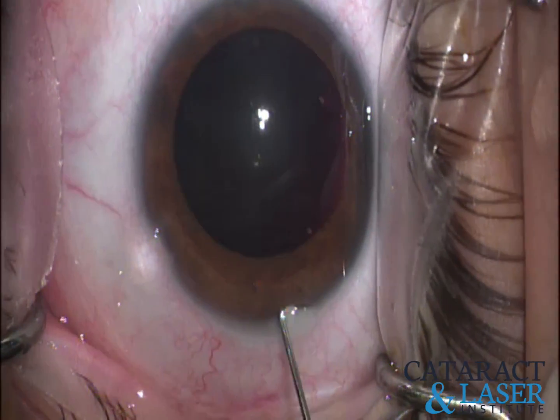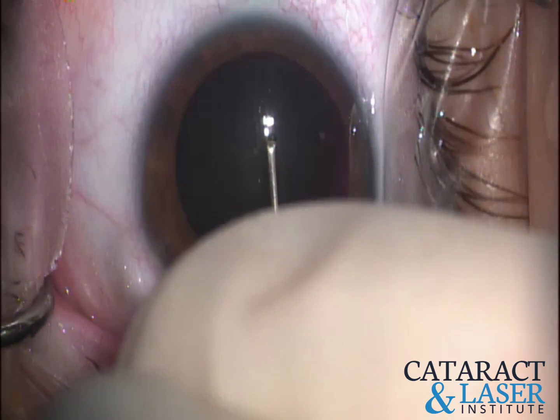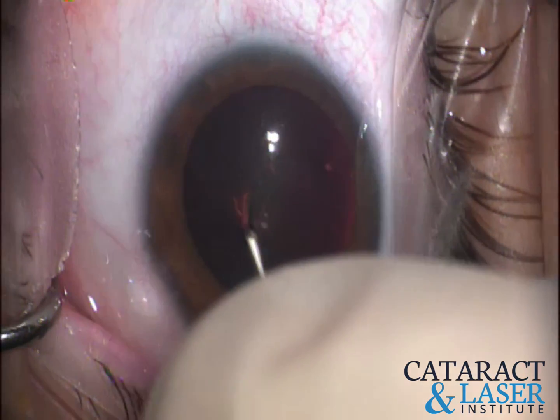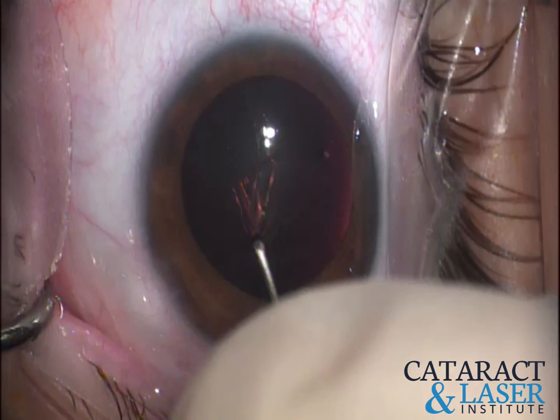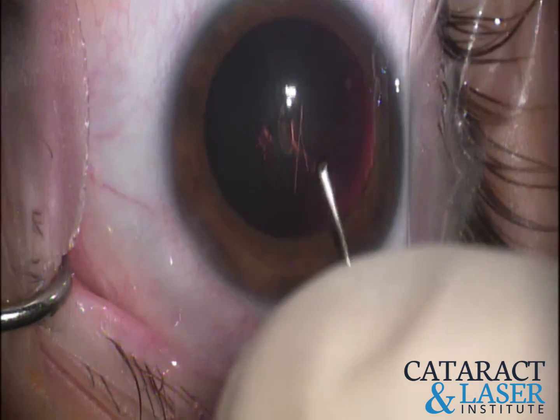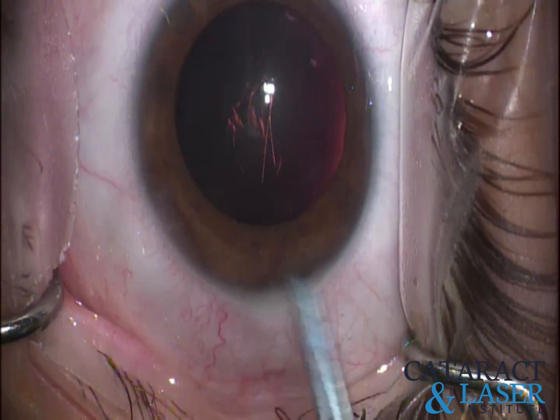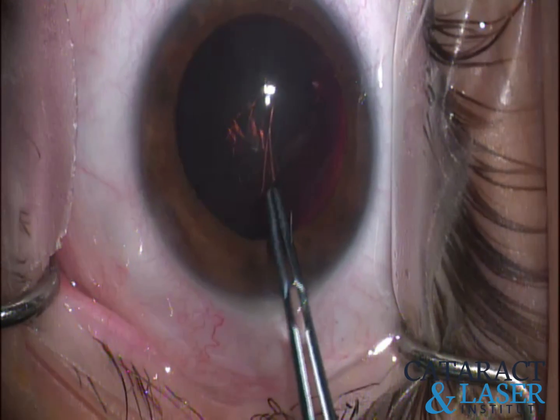Here, we like to use a bent TB needle to start our rhexis. I like to bring that straight down and then go through the sub-incisional area of that rhexis first — it makes it a lot easier from this point forward. The rest of the rhexis is relatively easy when you do the sub-incisional area first.